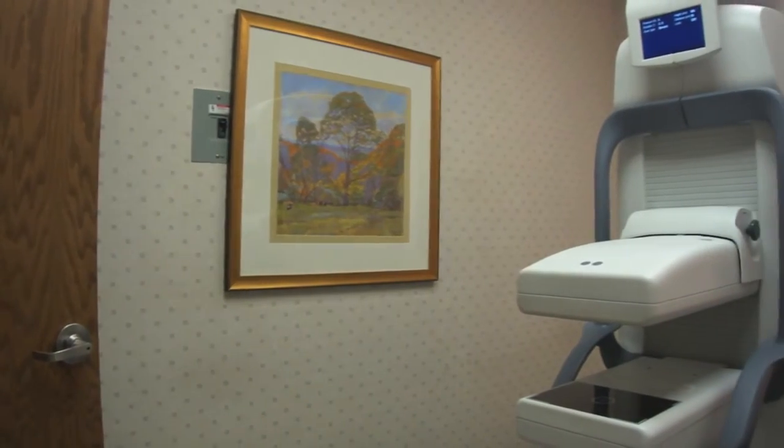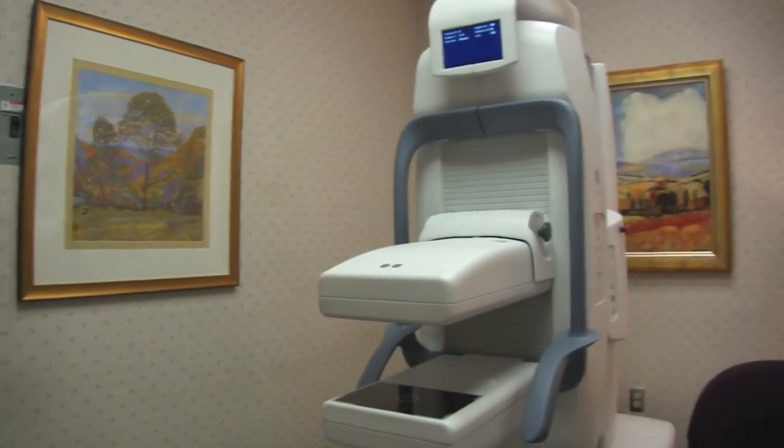One thing that a patient needs to be aware of before they have an MBI study is that there will be an injection of a small amount of radioactive isotope. This concerns a lot of people because of the word radioactive, but it is a very small amount. It's designed specifically to go to the breast, and your body expels it within a period of six hours through natural processes.